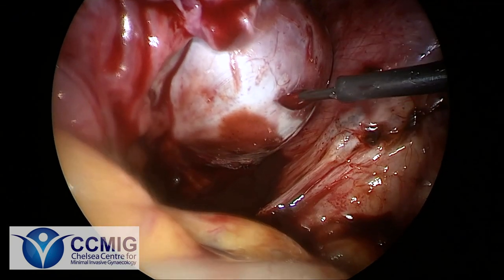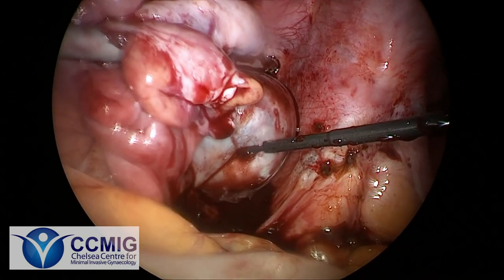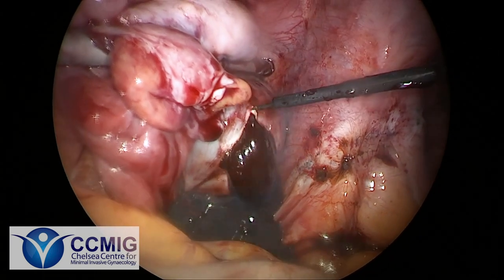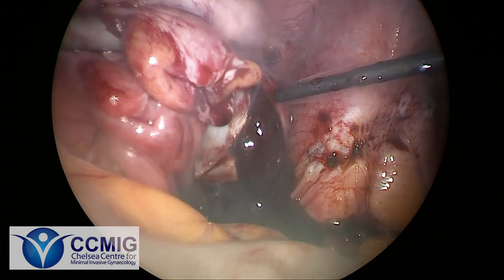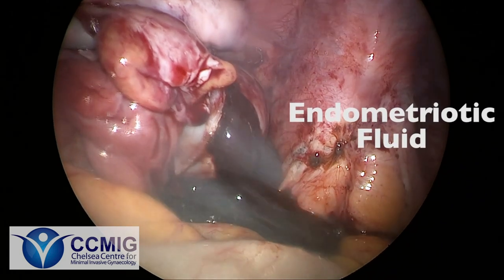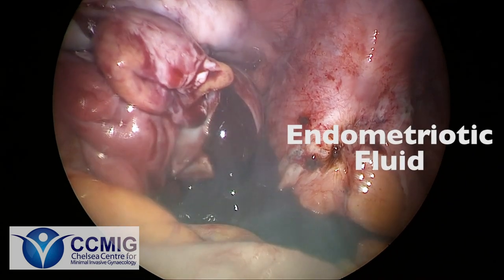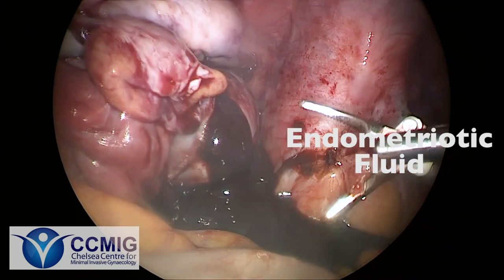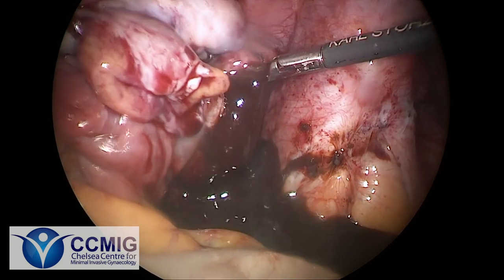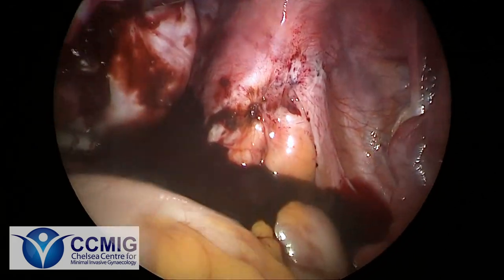This is a monopolar diathermy, which uses electricity to cut through the tissues. And there we can see draining of all that chocolate endometriotic fluid — you can tell why they call them chocolate cysts. This fluid is accumulated over a long period of time, contributing to an increase in the cyst size every time this lady had a menstrual period. Here we are trying to drain as much of that fluid as possible to allow the ovary to go back down to a normal size. Using our suction instrument and washing some fluid, we break down any small locules within the cysts to make sure we remove all the endometriotic fluid.